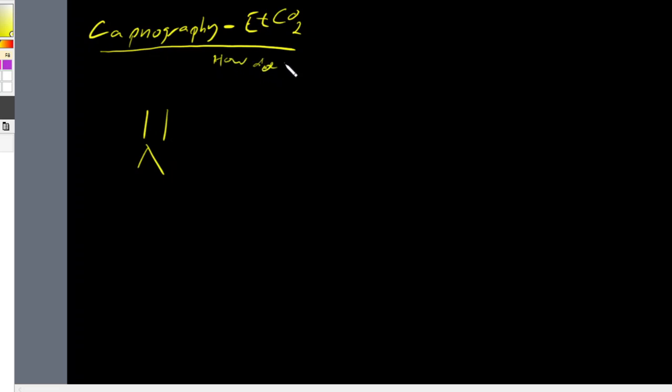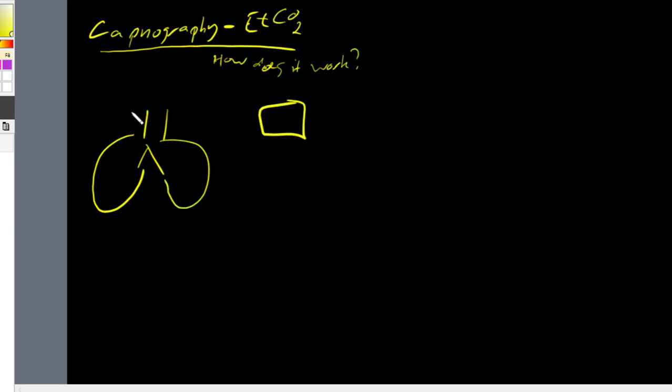How does it work? This is going to be a brief physics lecture. Here we have our lungs. Here we have our end-tidal carbon dioxide sensor, the CO2 sensor.